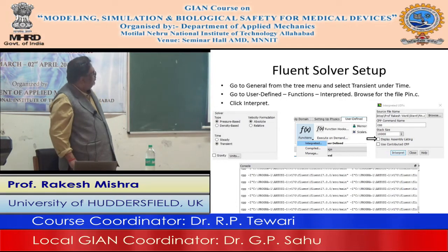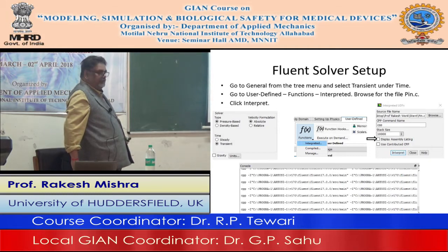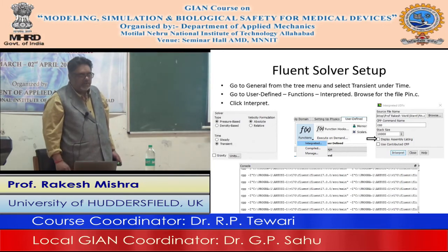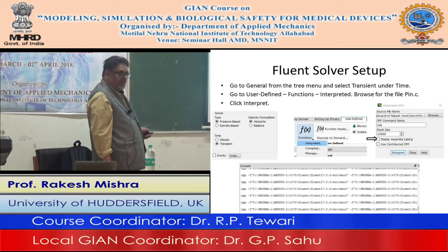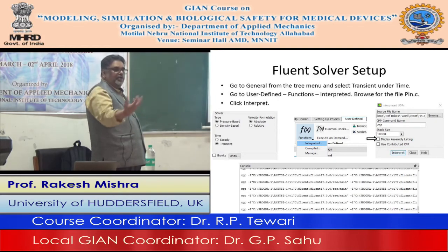And then we go to user defined functions, interpreted, and then we browse for the pin.c file, as we discussed that day with carotid. The pin.c file has the details of all the programming, which is here. This is the pin.c file saved at a particular point, and you can see it is simple C programming, and the pressure is varying as a function of time. So what it does is interpret this file and vary the pressure value depending upon this time.